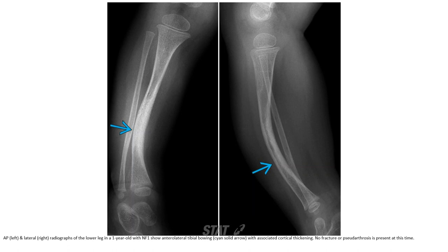This is the AP and lateral radiograph of the lower leg in a one-year-old with NF1, showing antero-lateral tibial bowing with associated cortical thickening. No fracture or pseudoarthrosis is present at this time.